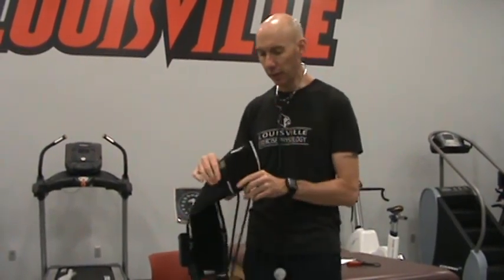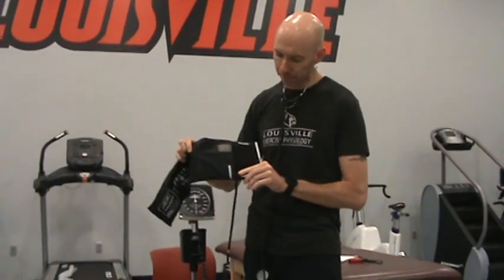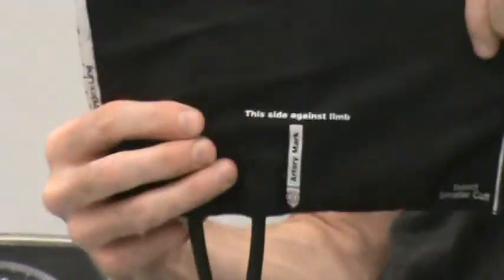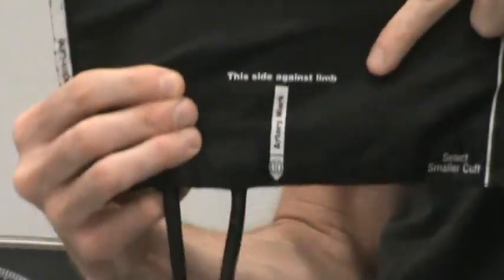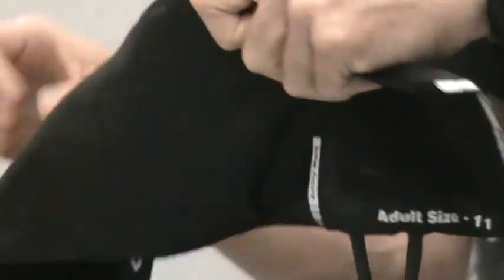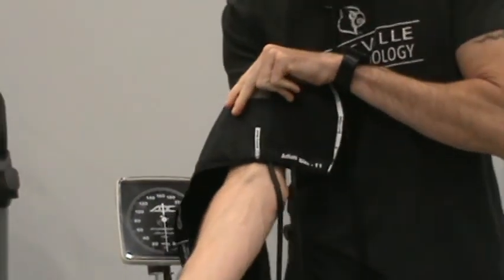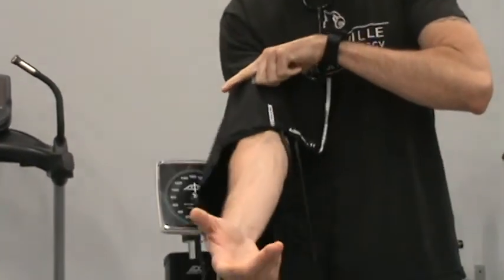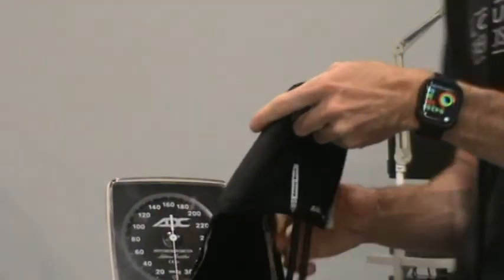Another thing to note here is there's an artery mark, and on this particular cuff, the artery mark is on both sides. And notice on this cuff, it says this side goes against the limb. So when I'm placing the cuff, I'm going to line up my artery mark with the brachial artery and make sure that the side that says place against the limb is against the skin of the individual.